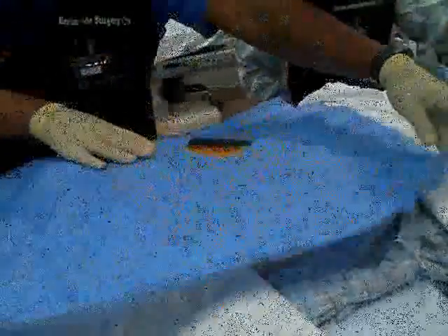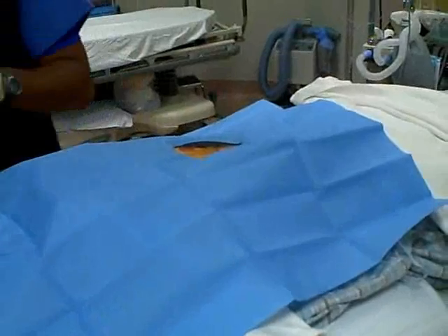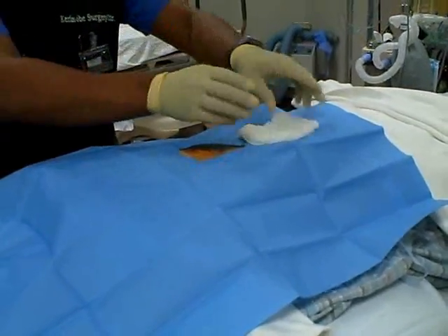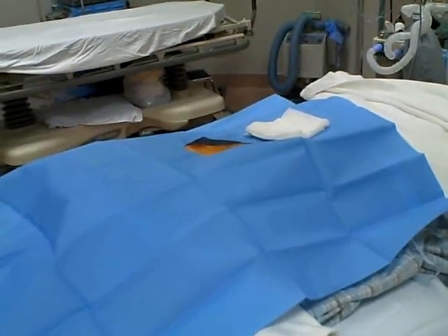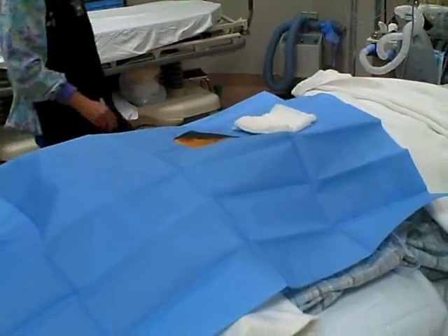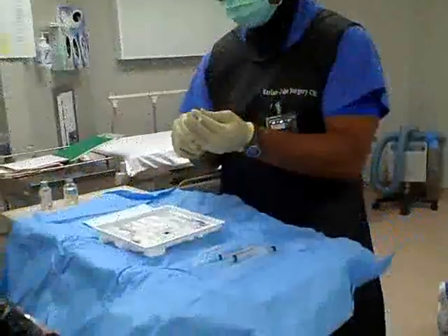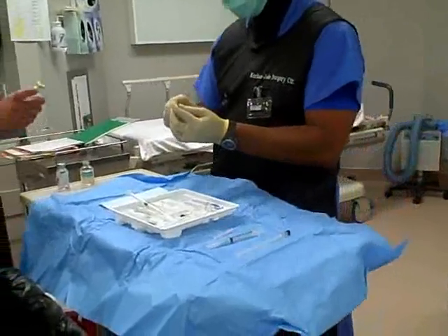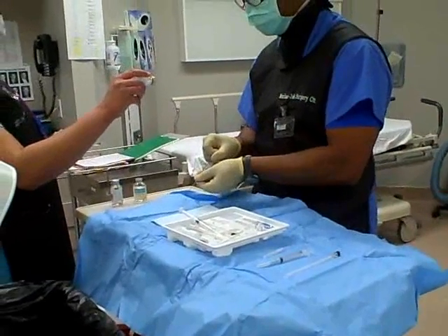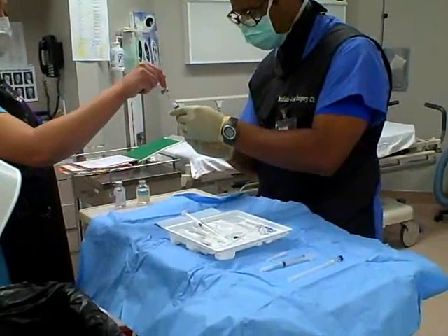After having cleaned and draped the back in sterile fashion, we turn our attention to drawing up our medications for injection. Now, typically, we'll have one syringe used to draw up local anesthetic, used to numb the skin and anesthetize the underlying tissue so that the rest of the procedure is very comfortable and painless.